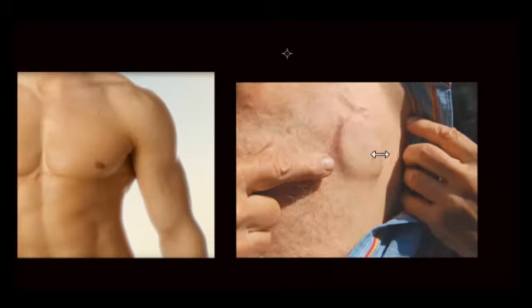It would look like a small bulge in the chest wall, and you can see some of the wire protruding underneath the skin, which is going into the heart for pacing. The pacemaker procedure generally takes anywhere from an hour to 2 to 3 hours, depending upon the extensiveness of the pacemaker. If you are just putting in a simple one-wire pacemaker, it may take about 45 minutes to an hour. After that, you return to your room and you rest.